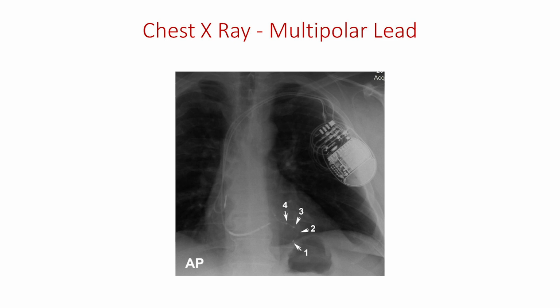And there is multipolar pacing where you can pace two areas in the LV and the RV, so you're capturing more myocardium. That has been shown in studies to give patients a response to CRT of 87%. So we see improvements with programming of the device.